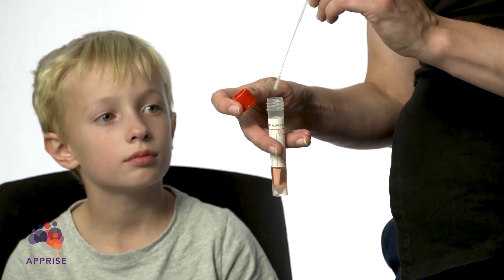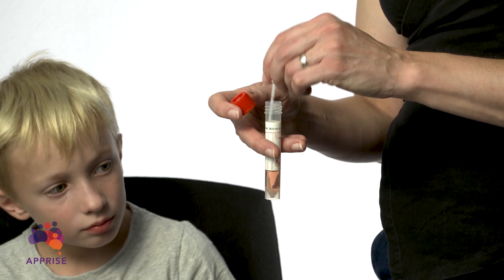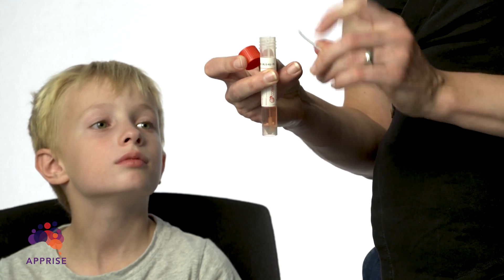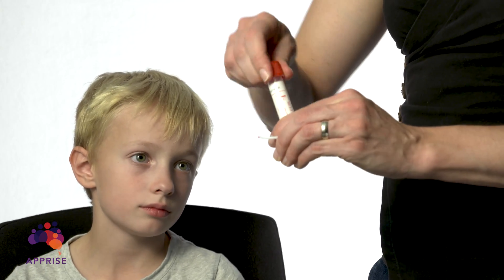Put the swab directly into the red-capped tube and mix it a few times. Snap the swab handle off of the line and tightly close the lid. Label the swab with your details and complete any forms given to you.